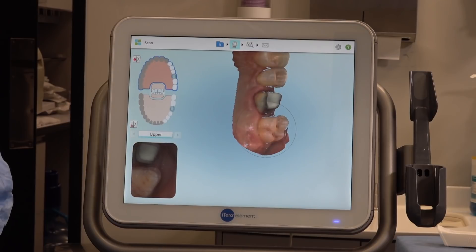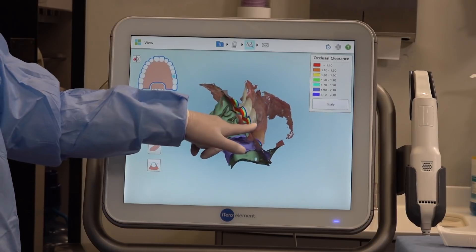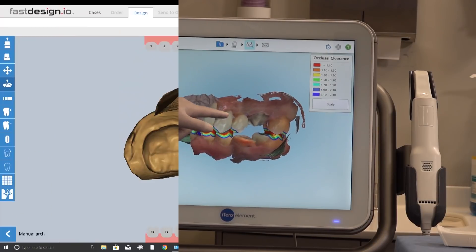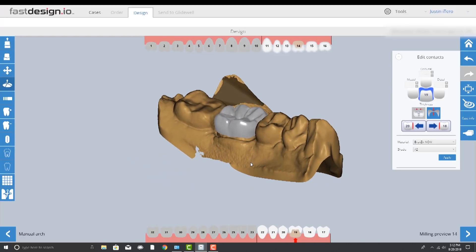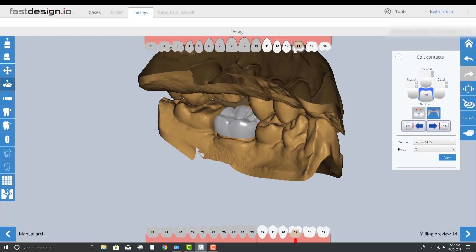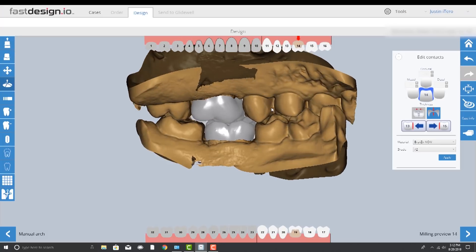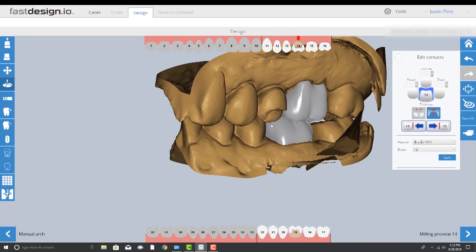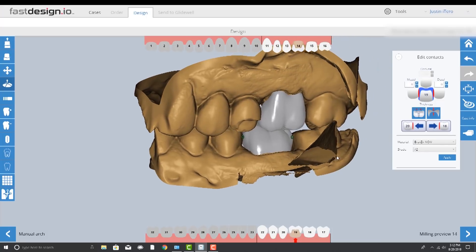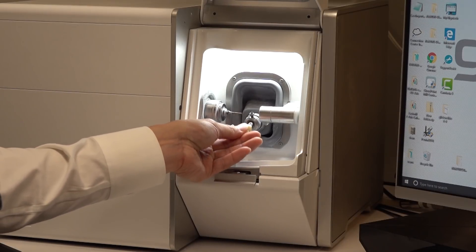The digital impression is then transferred to the FastDesign software where we're able to custom design both opposing restorations at the same time. I build both designs to better match the occlusal planes of the surrounding dentition and can easily verify the functional positions from both the buccal and lingual views. The final check is to establish the correct proximal and occlusal contact parameters. The great thing with digital is each clinician can custom set these values to their preferred settings.